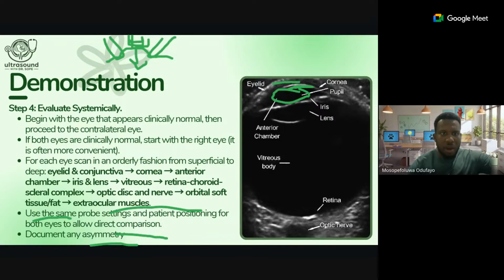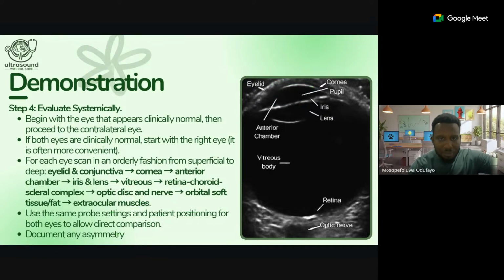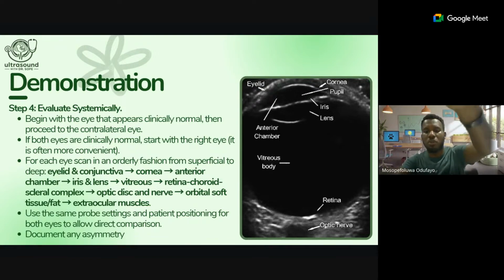You're checking the anterior chamber, which from the sonographic anatomy we know should be naturally clear. No issues inside. Then we are moving through the anterior chamber and we're trying to look at the posterior boundary of the anterior chamber, and we see the iris, which is the posterior boundary. We should see that echogenic iris. It usually has a central aperture, which is the pupil. If you move your probe, angulate it a little bit, you should be able to appreciate the pupil.